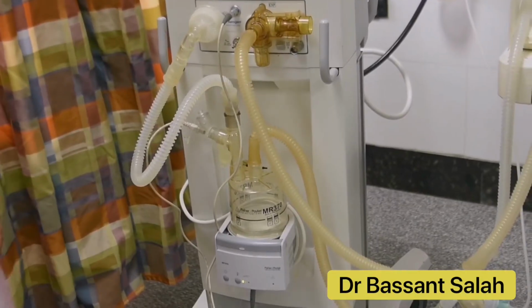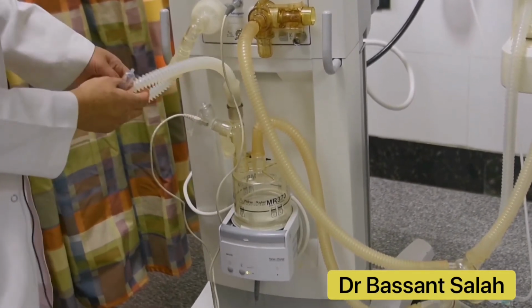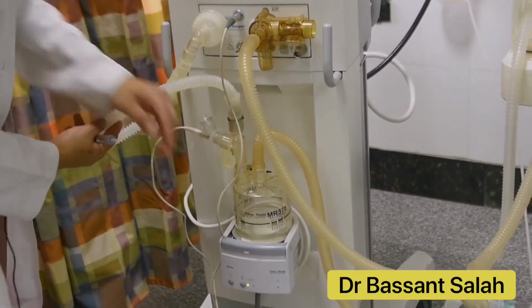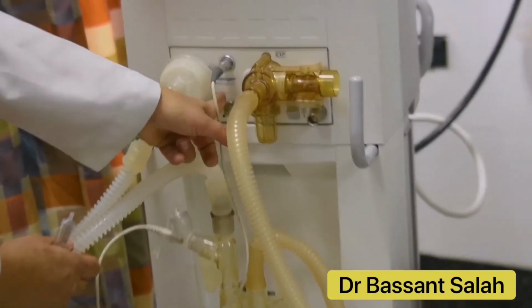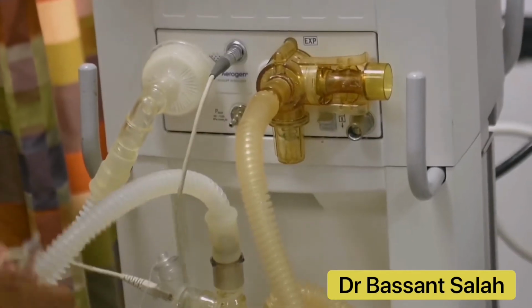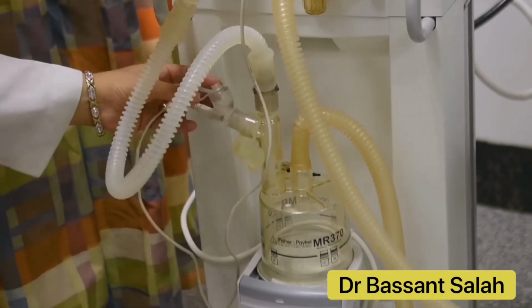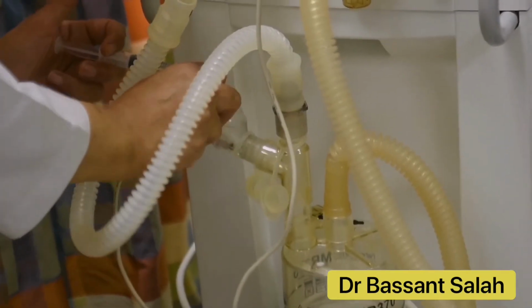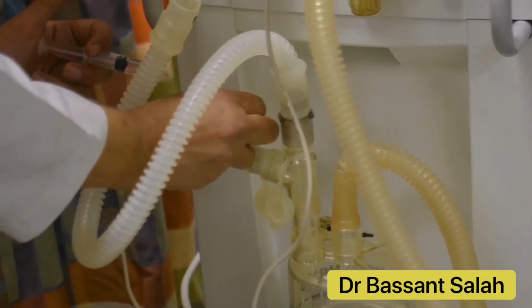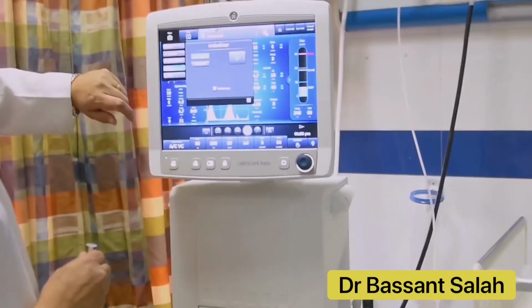The third type of nebulizer is the vibrating mesh nebulizer, and we choose here to connect it close to the ventilator and before the humidifier. The ventilator is supplied with the Aerogen outlet. It is connected here to the vibrating mesh. And here is the medication cup. I fill the medication cup with the medication. And we start here, nebulizer, Aerogen.